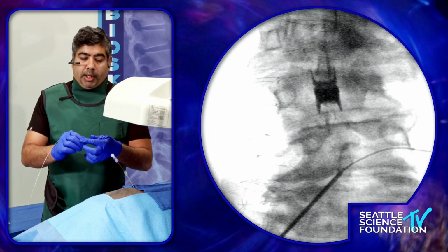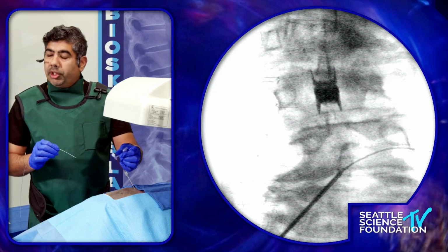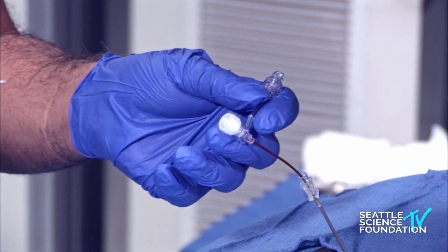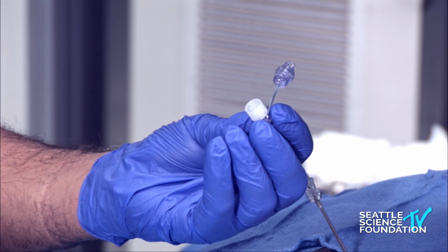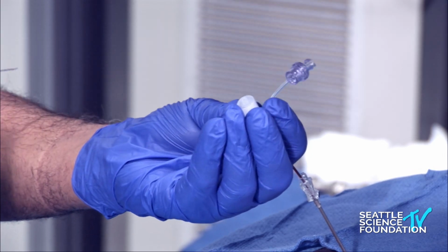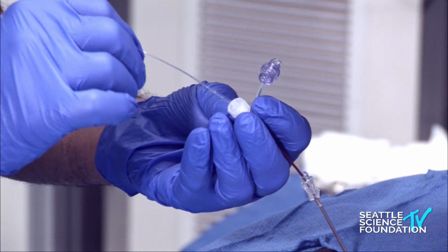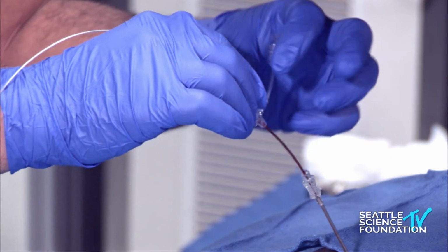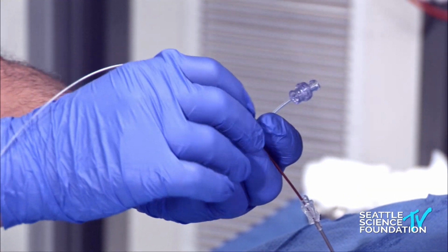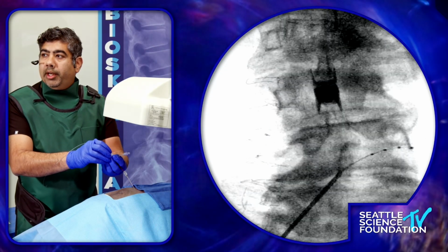So I'm going to swap the guide wire with the lead. I'm going to hold this. This extension, which we all see on the sheath, serves more as a clock indicator for me. If I have to move this lead to 12 o'clock, I position the extension at 12 o'clock. I think the camera is the other way around, but I position the extension at 12 o'clock. If I want to go 3 o'clock, it'll go 3 o'clock. Otherwise, 9 o'clock, 6 o'clock. So in a sense, I can use this sheath to aid the delivery of the electrodes in whichever direction I want. So those are my leads there.